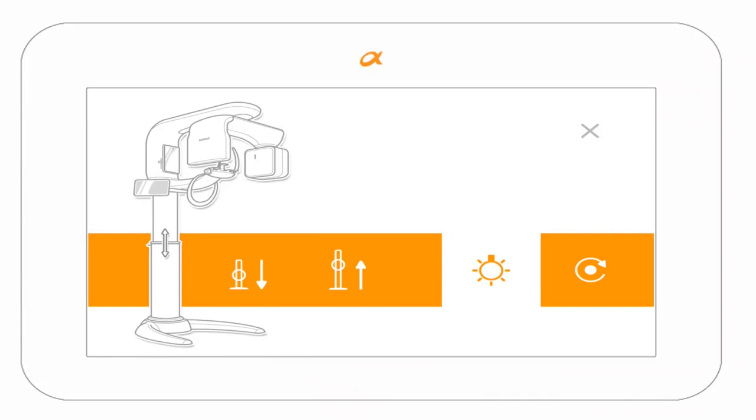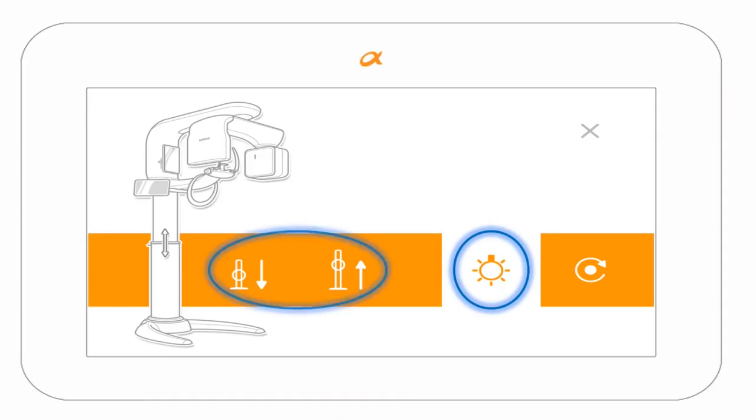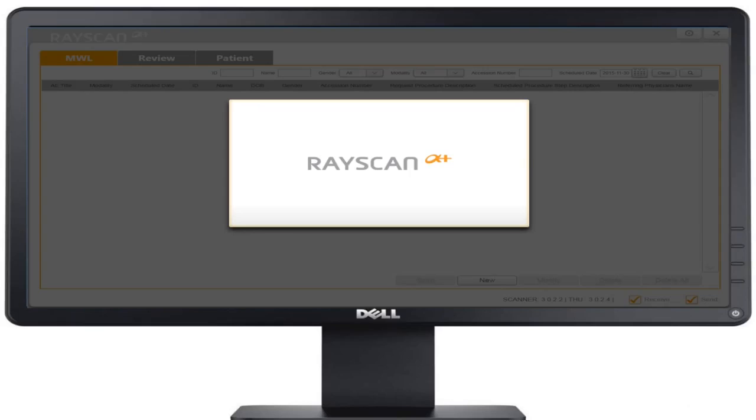The touchscreen selections include the laser alignment lights button, up and down buttons, and the reset button.